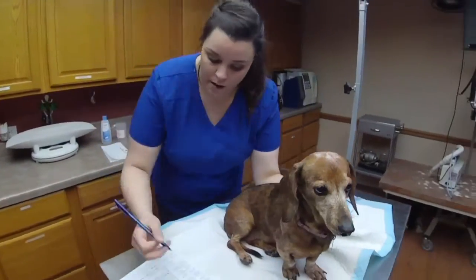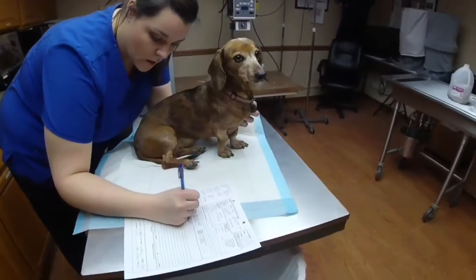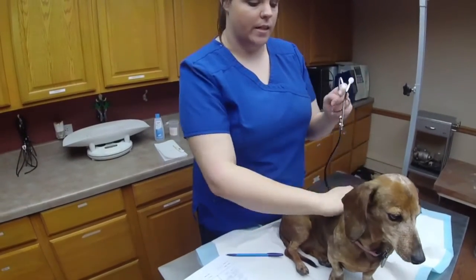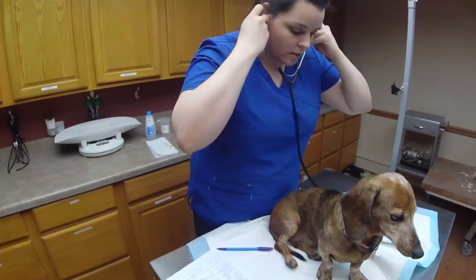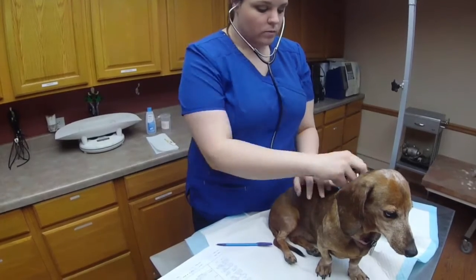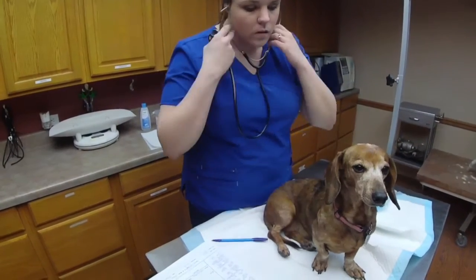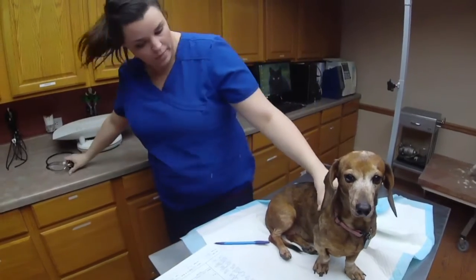Her rate is about 120. Listen to her lungs. We are listening for any wheezing or congestion that we can hear if she has any. She's fairly healthy, so I don't think she will, but no, she's golden.